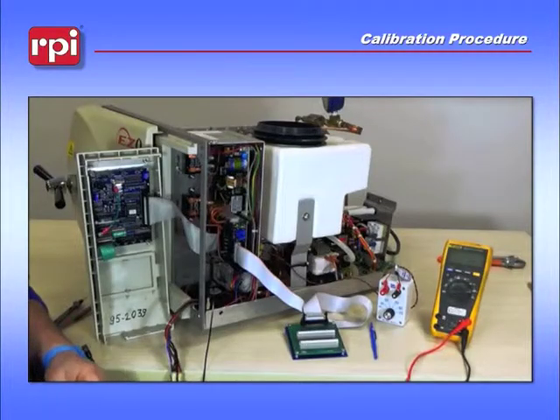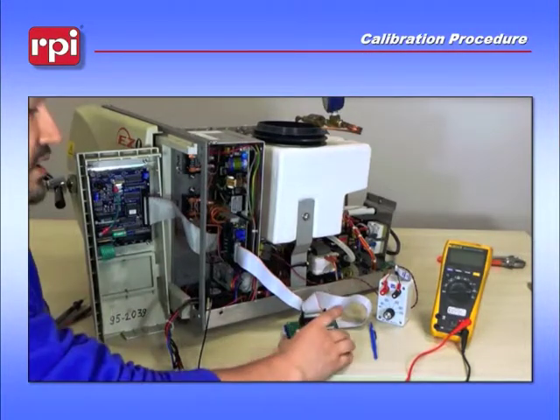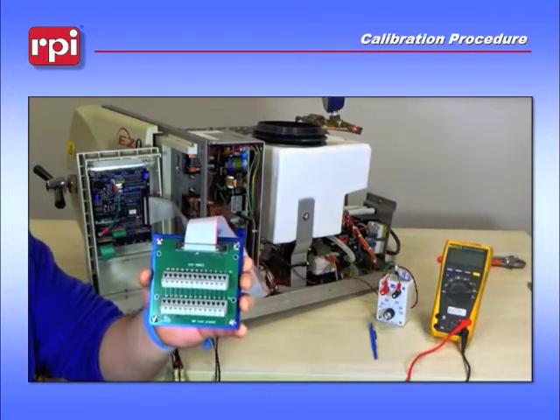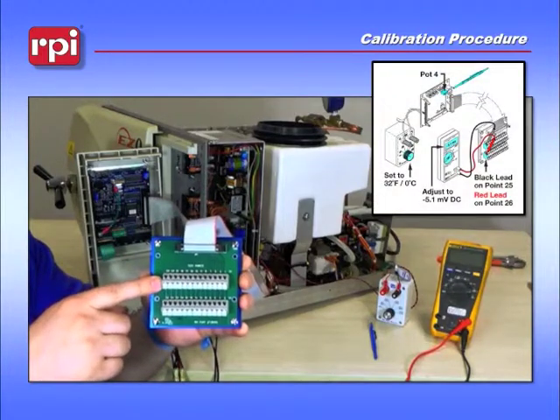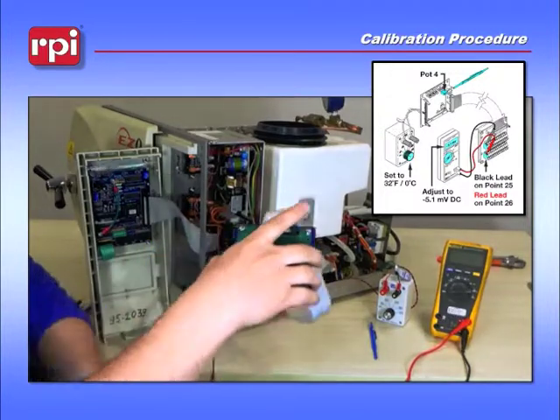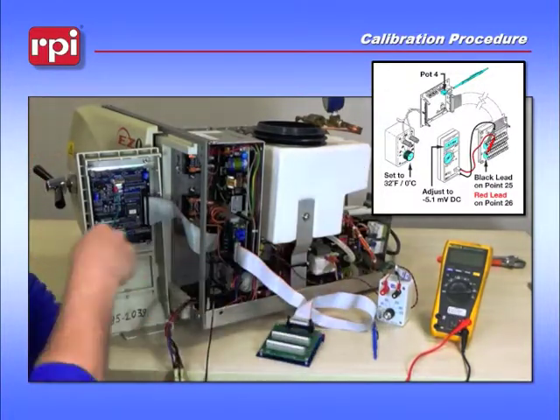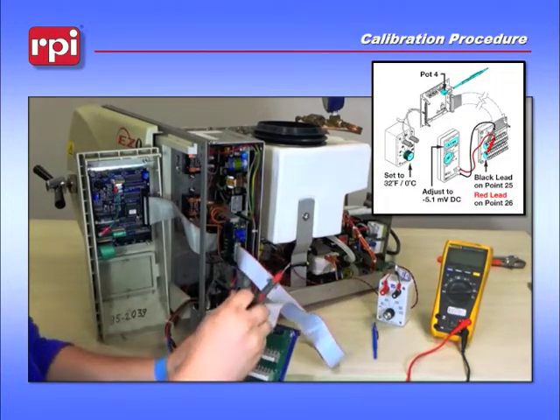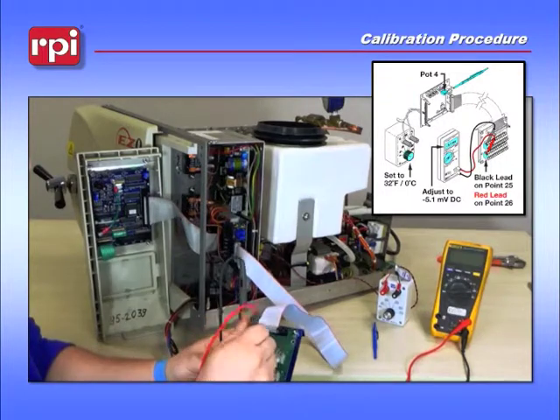To begin your calibration procedure, first turn the machine on and let it run through the post-test before you actually begin. Next, grab your TUB-109 test point board. Connect your black lead to test point 25 and your red lead to test point 26. This is important because you're looking for a negative voltage, so black lead at test point 25 and red lead at test point 26.